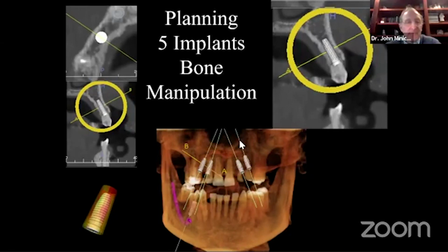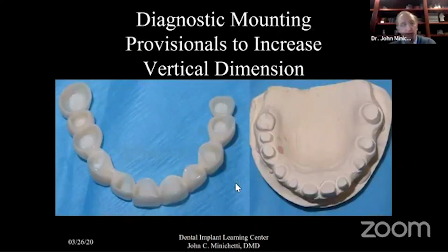So we did some planning on these cases, and the bone is a Seibert class 1 or a Misch B, and it's narrow, but with some bone spreading or bone manipulation, this certainly can be managed, where we can put some implants in our prosthetic positions and align her and actually shift or widen her smile because her primary teeth are actually more spaced out.